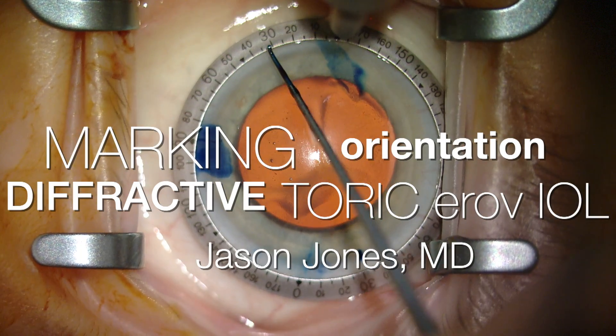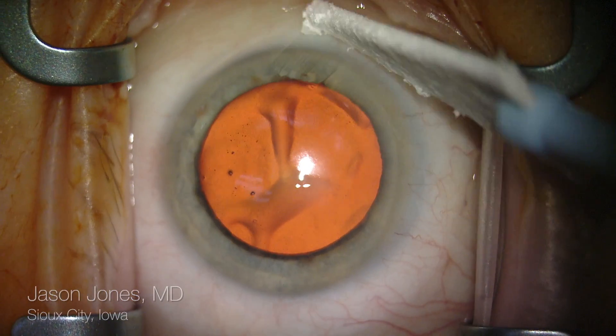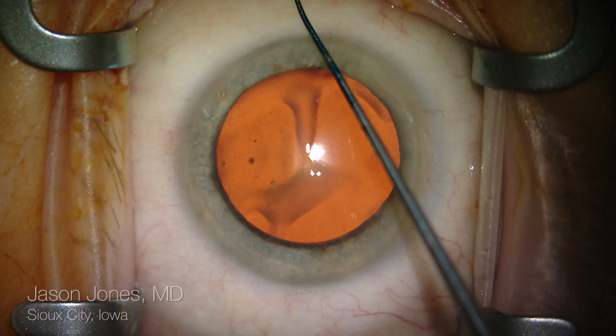Hello, this is Jason Jones, and in this video I'd like to demonstrate my technique for marking and orienting a diffractive extended range of vision lens.